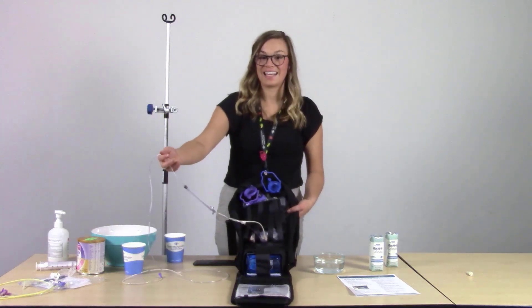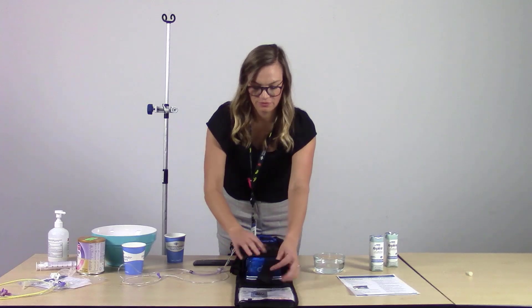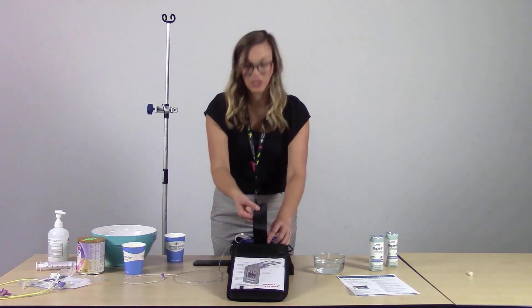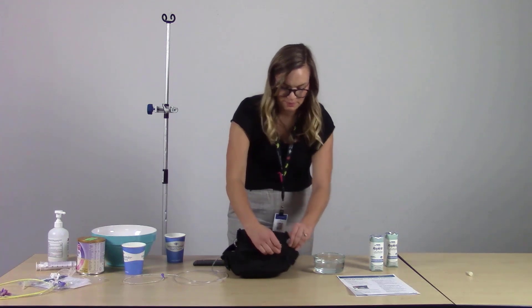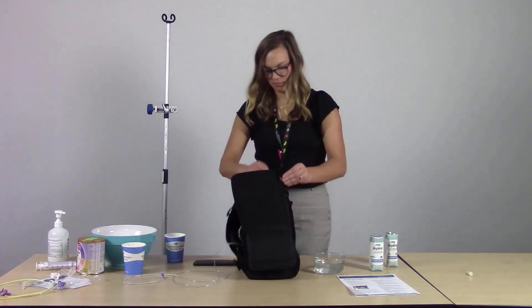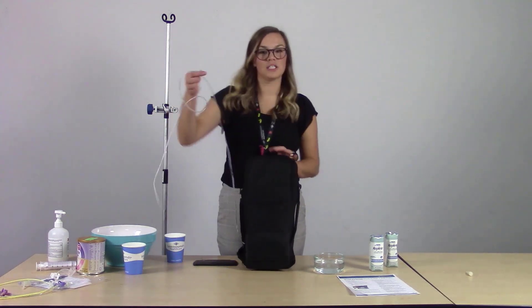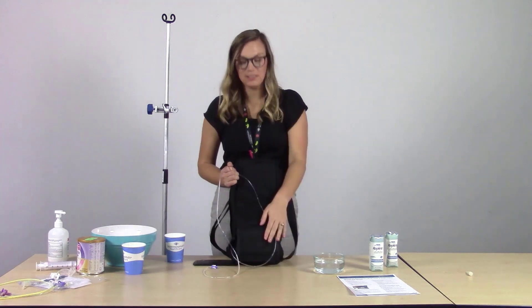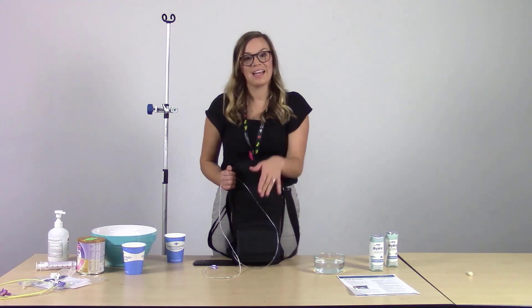Ensure that the tubing does not kink in the backpack. Secure the Joey Pump into the front pocket, feed the bag set through as done previously, close the door, and zip up the backpack. The tubing will stick out and connect to the patient; the backpack can be worn on either the side or on the back. Note that because the pump is not hooked up to AC power, it only has 18 hours of battery life, so be mindful when out in public.